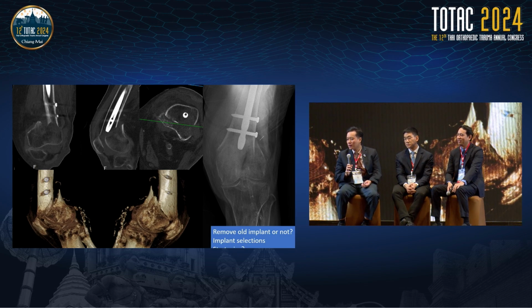I have to refer to the classifications that I have mentioned. Is there any healing of the proximal part? Yes, it's already healed, 8 years ago. Okay, so now we have to attack just the distal part. Yes. Also, you mentioned there's quite osteopenia of the bone. Yeah.